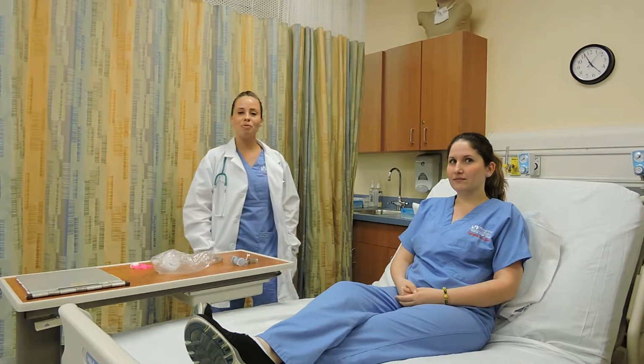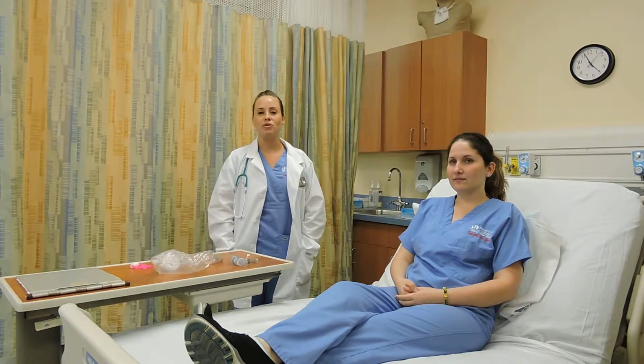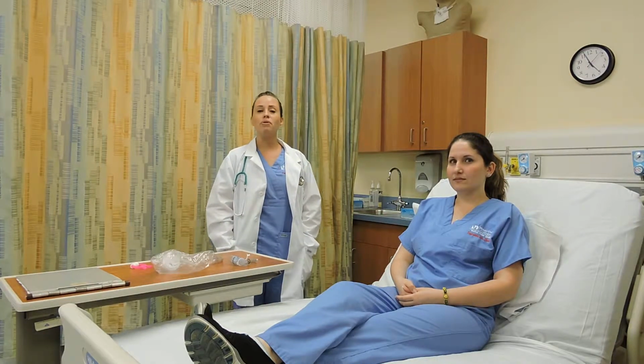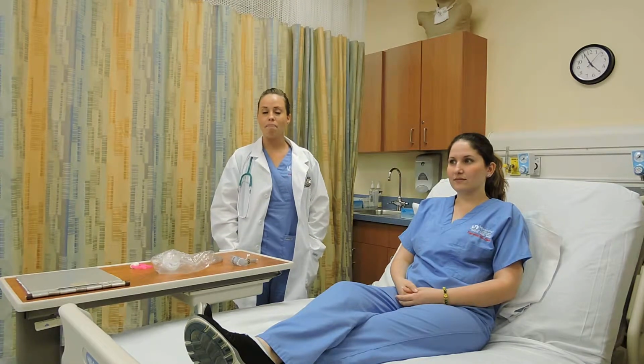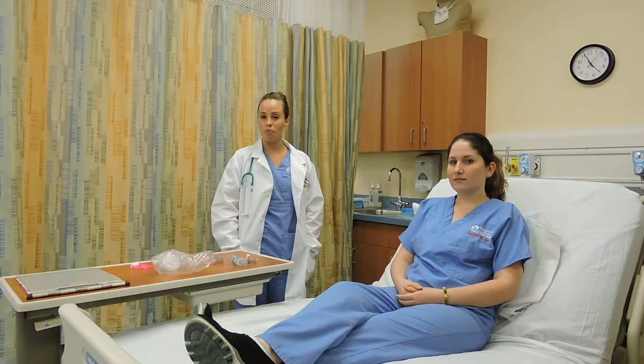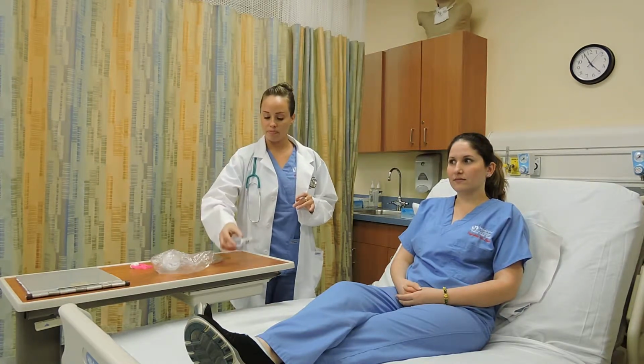Hi, my name is Maria Perez-Rojas, and I'm a respiratory therapy student at Miami-Dade College Medical Campus Center. Today's topic is going to be about PAP as an adjunct of bronchial hygiene therapy. PAP stands for positive airway pressure, and the equipment I'll be using today is called EzPap.